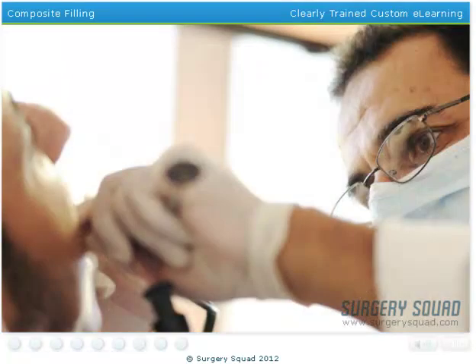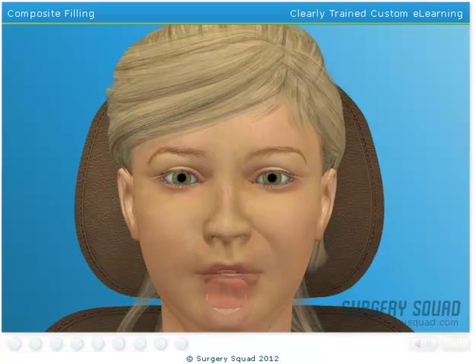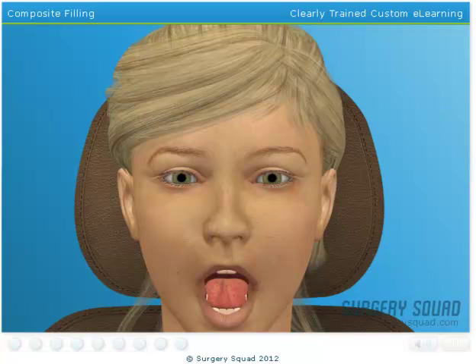At this point, the dentist checks the patient's bite to ensure that everything is normal and the patient doesn't experience any discomfort. Fortunately, you did an amazing job, and there doesn't appear to be any issues with the filling or our patient's bite. All done — it looks perfect.